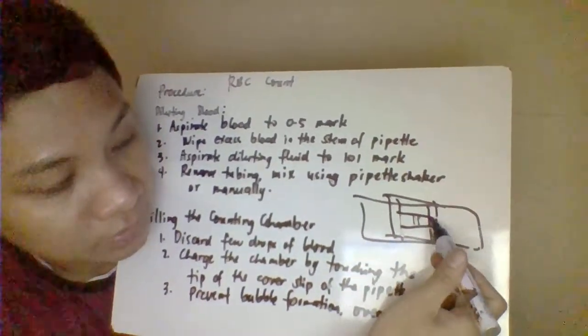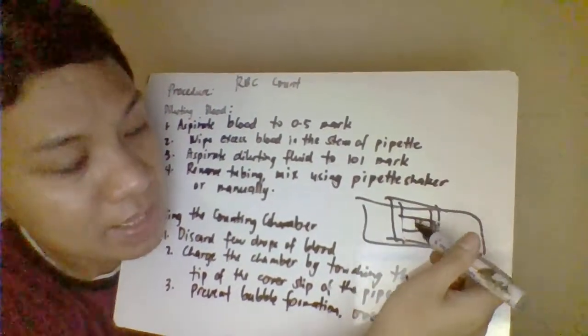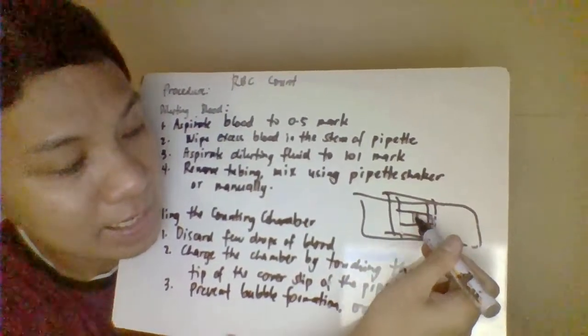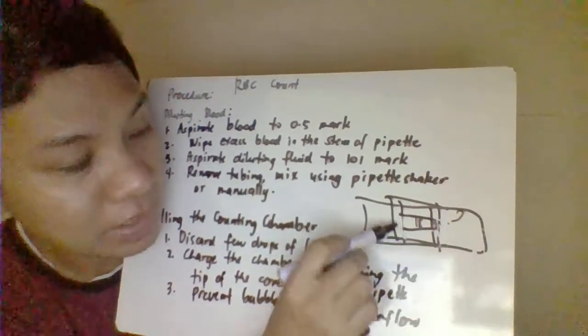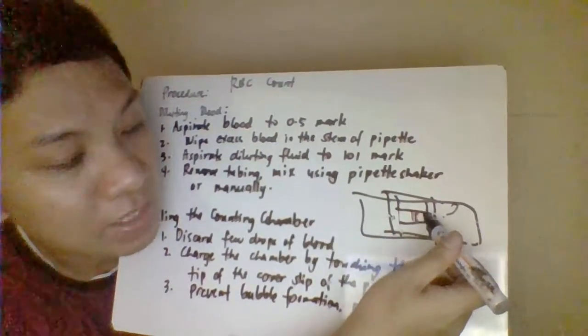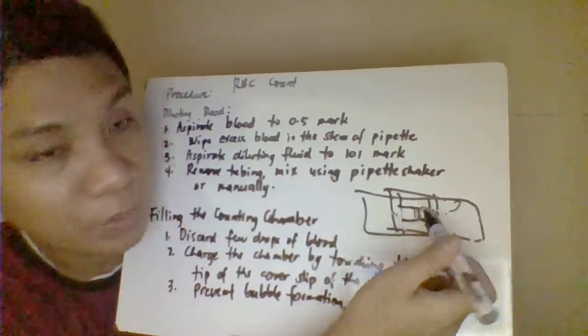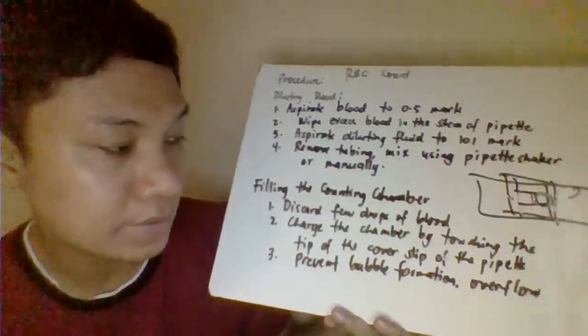So ito siya. Dalawang side kasi ito. Dito ka, make sure na hindi siya lumagpas dito kasi kanal na ito. So mean to say, hindi dapat siya nag-overflow. Pag dito naman sa kabila, so dito ka naman mag-charge. And make sure enough lang siya to cover this one entire area mo na ruled area where you try to count your cells.